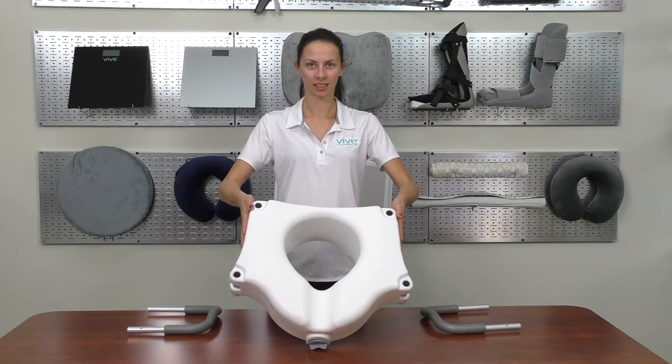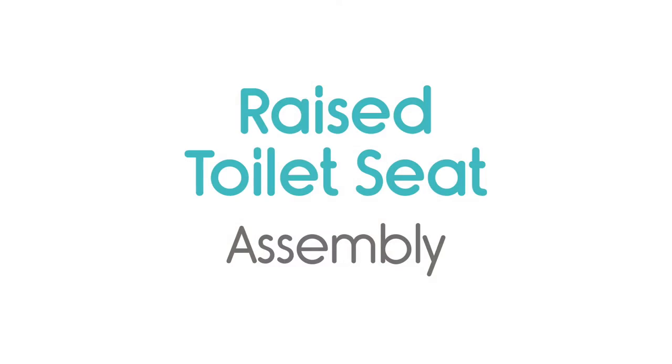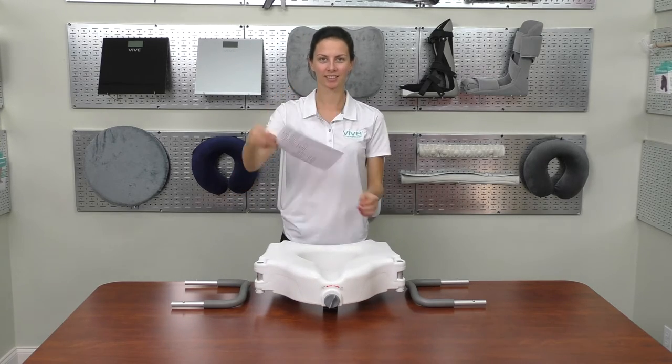One raised toilet seat, two arm rests. Remove product from carton and read instructions carefully before attempting to install the product.